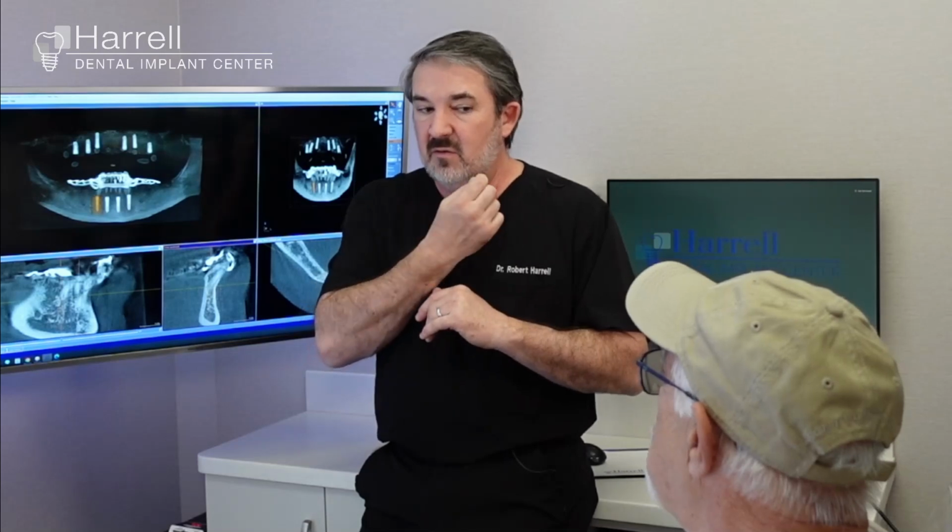Seal. Yeah. It's not going to 100% keep food or liquids or anything from going underneath the teeth. So you still have to go in and clean. You still have to use a little floss pick to go under them. It's just near impossible to make them such that, right, because the gums have so much flexibility.